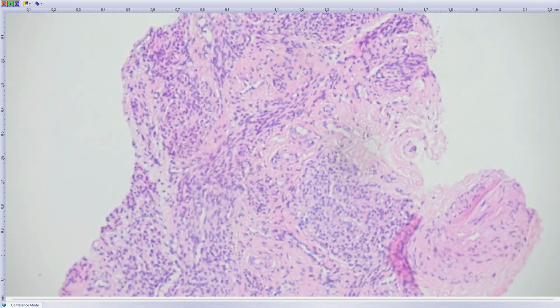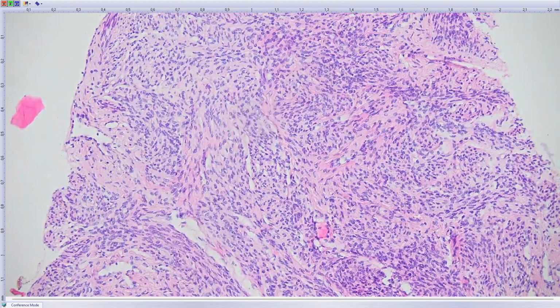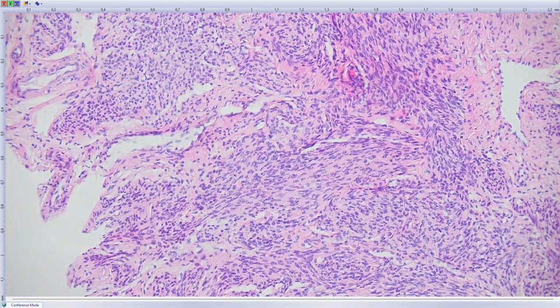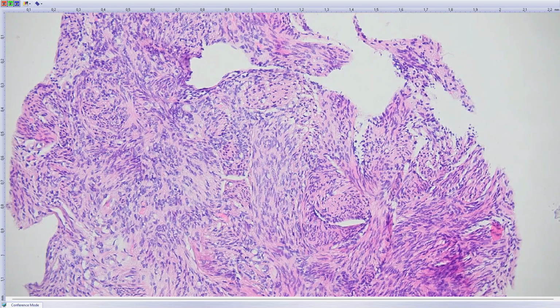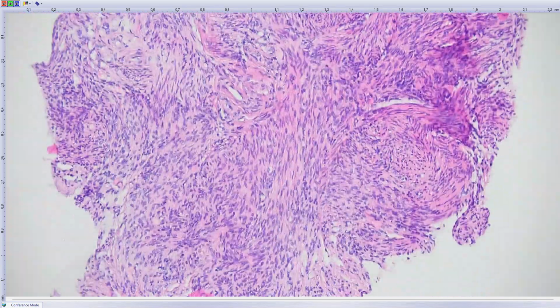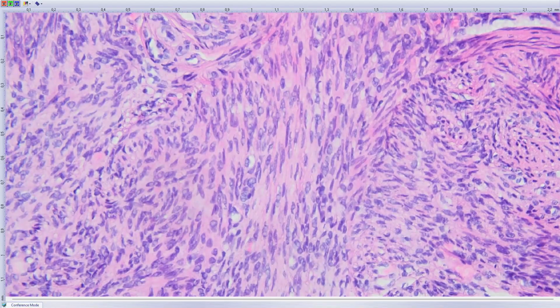So this is a punch biopsy from the peritoneal lesion, which looked so suspicious for metastatic disease, potentially some gynecological carcinoma. But as you can see here, this is rather composed of, again, spindled cells, relatively bland, without mitosis, and with quite prominent eosinophilic cytoplasm. Sometimes it's arranged in somewhat intersecting short fascicles. And when the tumor cells are cut longitudinally, you can see cigar-shaped nuclei, as here in the center.